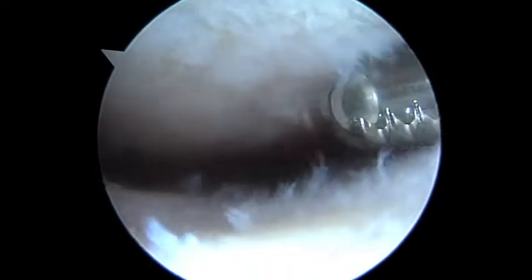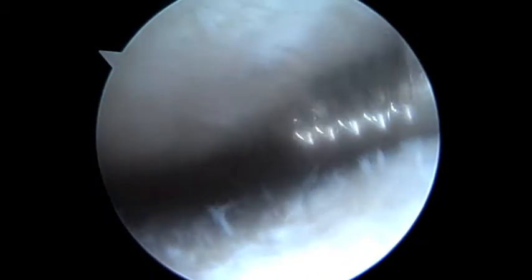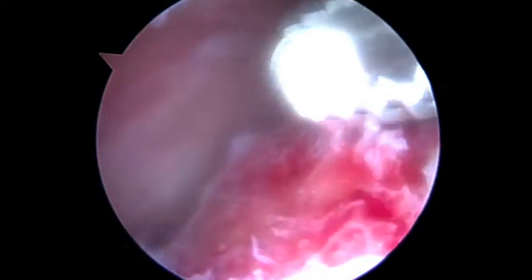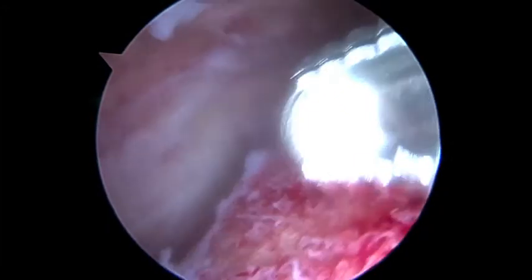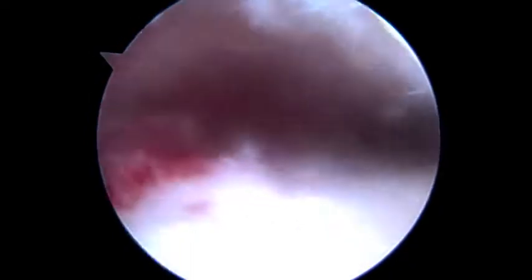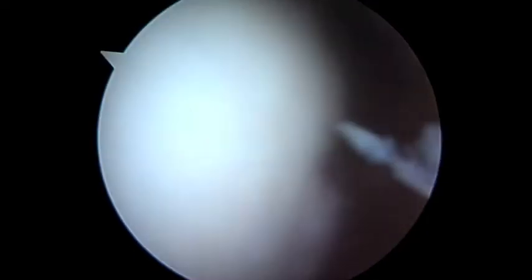We've been working on this patellofemoral joint for quite a bit, just removing some of the spurs and smoothing out some of the articular surfaces. I think we've done as much as we can do here. That's the patella at the top of the screen. The next step is going to be to do the stem cell injection. You're going to get some swelling in the knee, but I think it's the right thing to do to get some of those big spurs off that were causing a lot of pain in the patellofemoral joint.